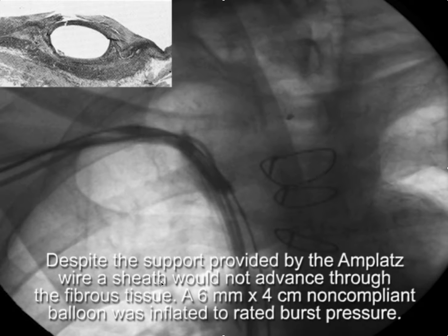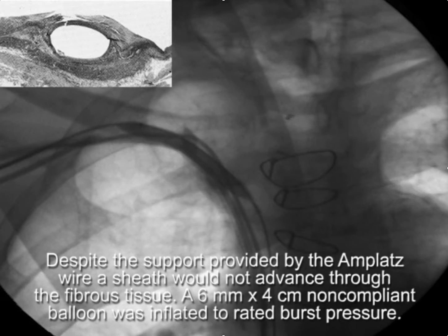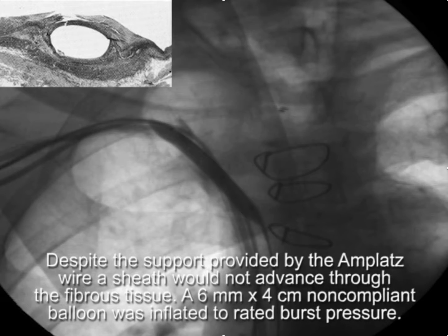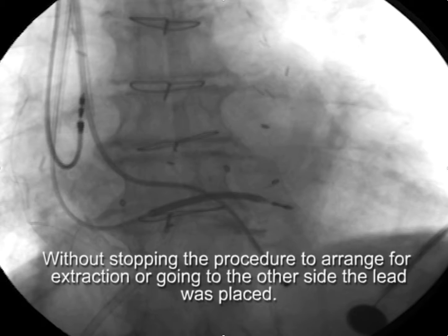Despite having an AMPLATZ wire, we could not advance a sheath over it through the fibrous tissue, because we wanted to add an ICD lead. So we took a 6-millimeter by 4-centimeter non-compliant balloon and advanced it over the AMPLATZ wire, inflating it to rated burst pressure. You want to start distal to the occlusion at the innominate SVC junction and then do a head-to-tail overlap until you see the tail of the balloon in the pocket.